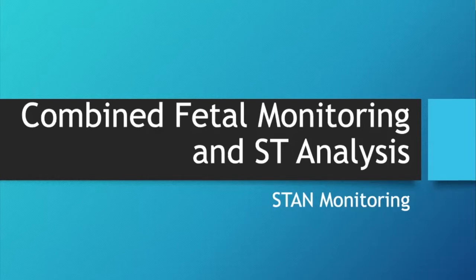Okay. So ST monitoring is a combined fetal monitoring and ST analysis. And the emphasis is on combined fetal monitoring. It always starts with fetal monitoring. Okay. And then comes the ST analysis. It is an adjunctive technique. It is a way of trying to figure out things when things are confused. If we are not confused, we should not try and muddle ourselves up. Is that clear?